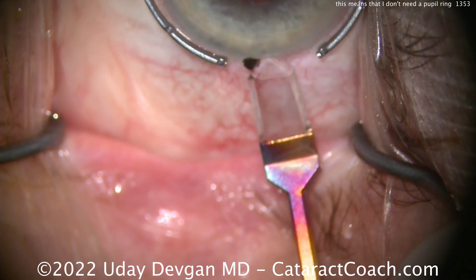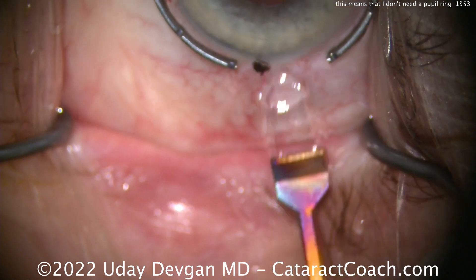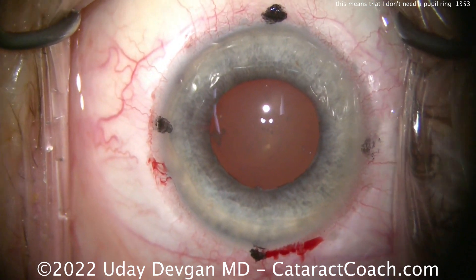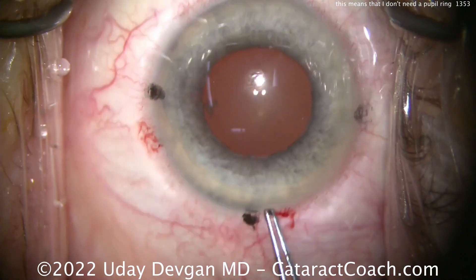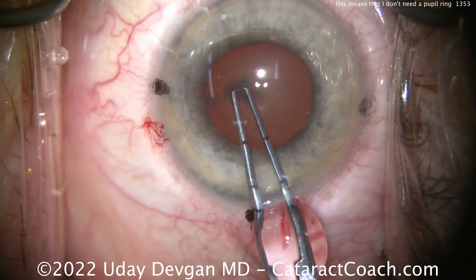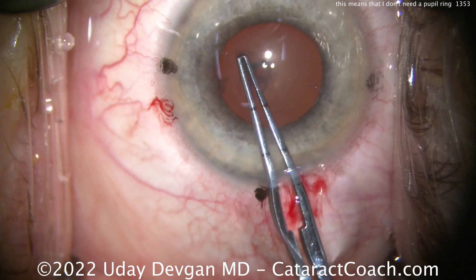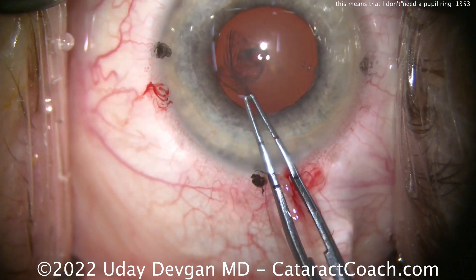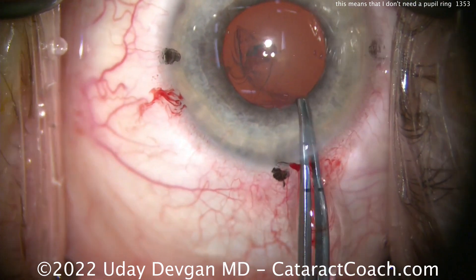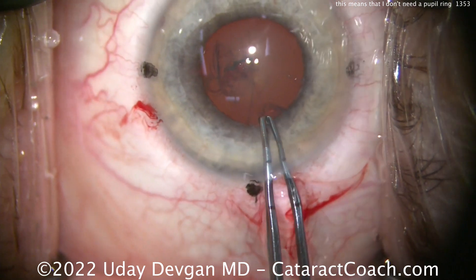Let's make our main incision here using a diamond keratome. Now here's how I measure the pupil. My forceps are marked off with two marks: one is two and a half millimeters, the other is five millimeters from the tip. That sign just there — I did it very quickly — shows me that this is a five millimeter pupil. There are no corneal magnification or minification issues because the instrument is inside the eye. So that's a solid and honest five millimeter pupil.